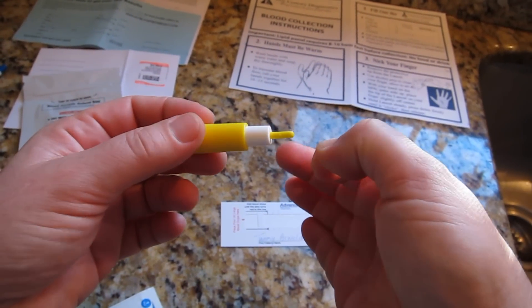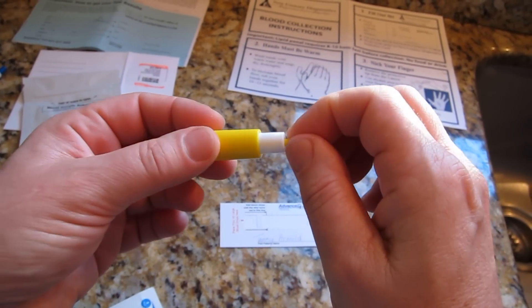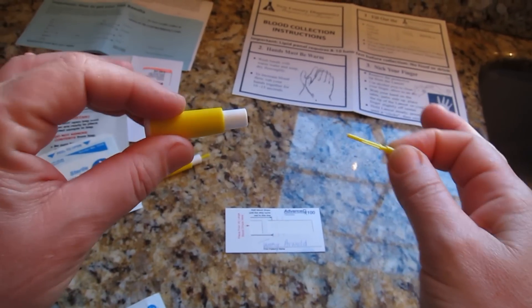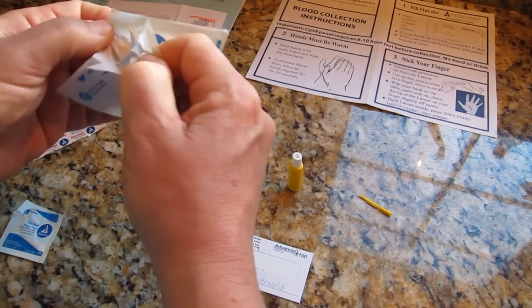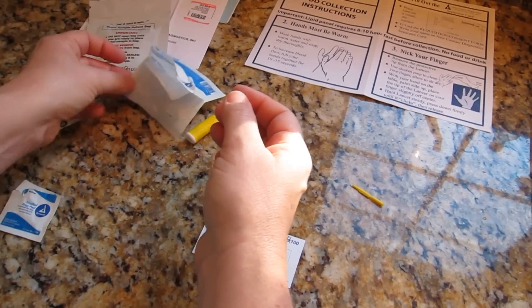Next, take the yellow lancet and twist the tip off — twist the tip and then pull to remove the protective cap from the lancet. Set the lancet aside. Go ahead and open the gauze and the band-aid so it'll be ready at the end of your test.